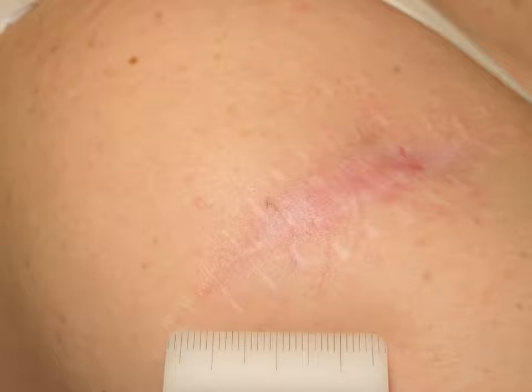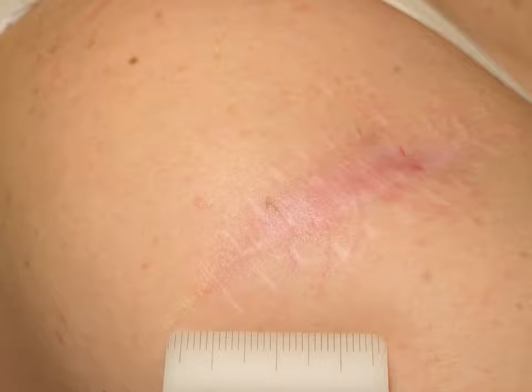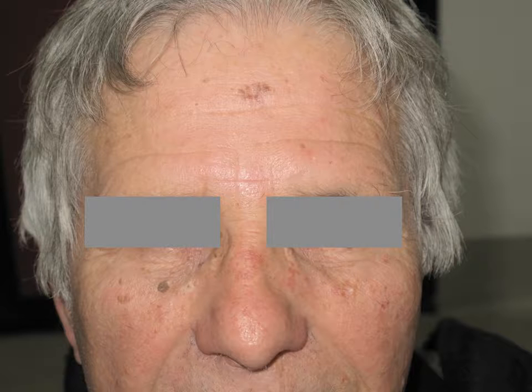Here is one example of recurrent melanoma in situ. In dermoscopy, we see heterogeneous pigmentation starting from the edges of the scar and going into the surrounding skin.